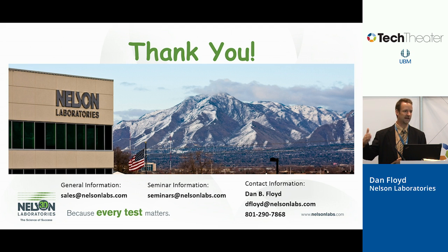So doing it quarterly, or at least multiple times during the year, allows you to see any seasonal variation, or anytime you add new people to your clean room, you fire somebody, you hire somebody else, they potentially may be bringing in new bioburden that you didn't have before. And so by doing it at some type of interval, again, there is some leeway for you to establish what that may be. The nice thing is once you characterize your bioburden and show it's consistent, then you can reduce the number of samples and maybe even the frequency. Because again, with ethylene oxide, it's not a bioburden-based method.